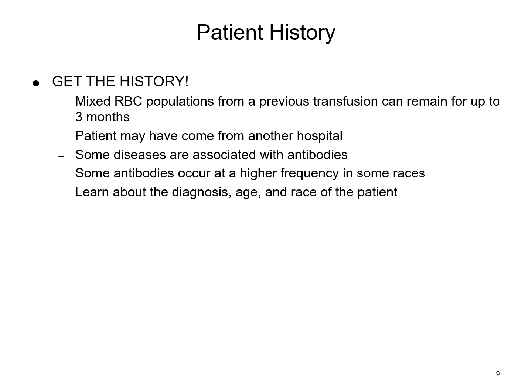Because if your patient has previously been transfused within the past 3 months, then you know that you're going to have a mixed red blood cell population. So as you recall from hematology, a red blood cell will survive how many days? Approximately 120 days. So 120 days is 3 months. So we can pretty much just assume if a patient's been transfused within the past 3 months, then there are probably some donor red cells still within that patient.